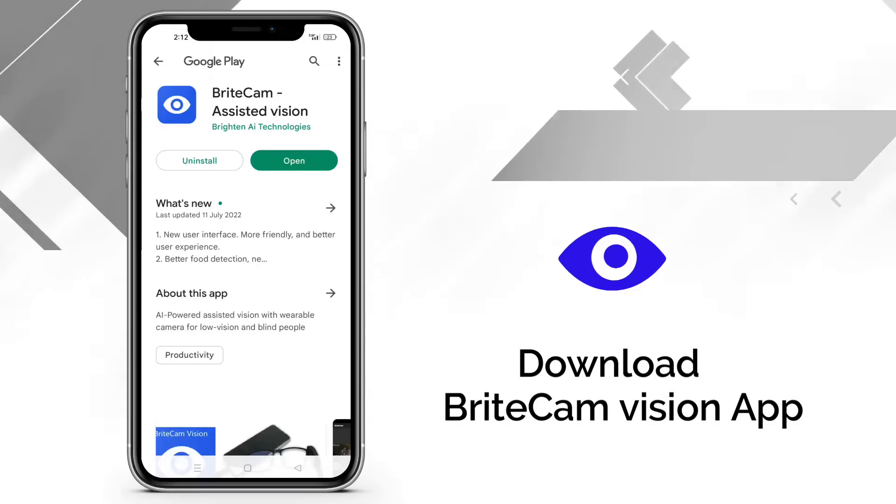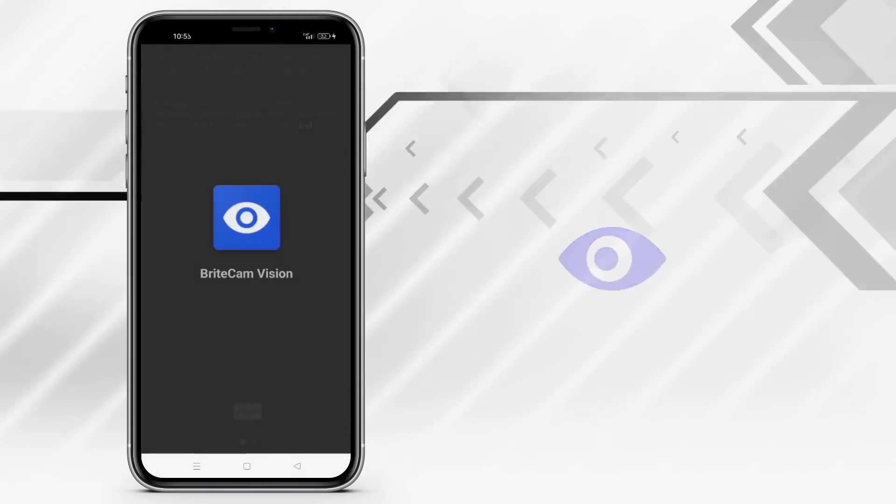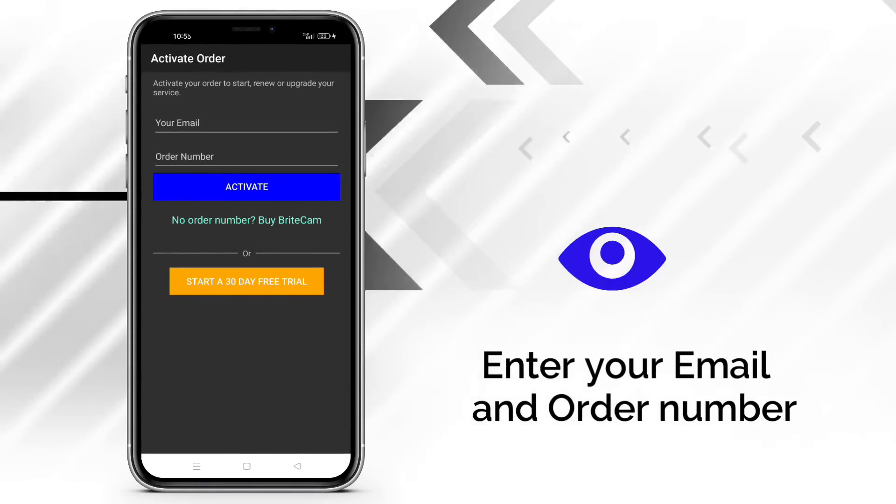Download BriteCam Vision app from the Google Play Store. Enter your email and order number.